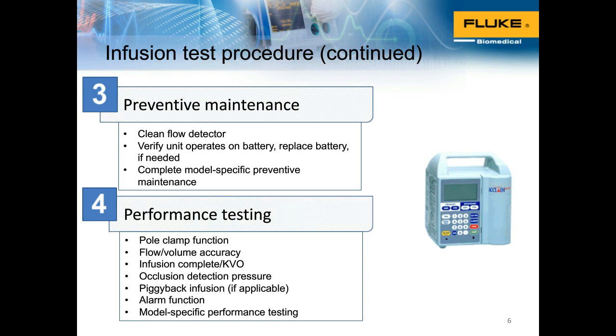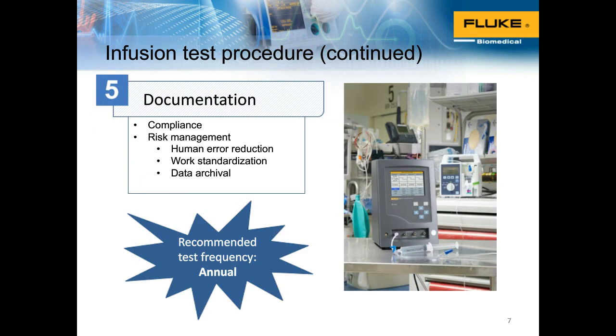Generally, when we talk about infusion pump testing, electrical safety, preventive maintenance, and visual inspection are in one bucket, and the performance testing, which is flow, volume, is something that is more rigorous. And also, this is where a lot of the errors come into place. You have to be very careful because that's where a lot of the malfunctions happen in infusion pumps.